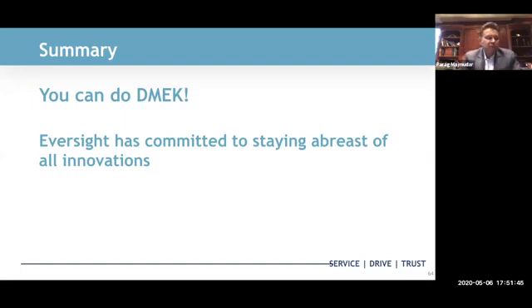If you're asking about how to estimate the size or the amount of the bubble post-op, so in the clinic the next day, it's really ballpark. I'm not sure it really matters that much whether it's 80% or 85%. The number one thing is that it clears the inferior iridectomy, so that there's aqueous covering the iridectomy. That way you know that there's continual flow and you're not going to have pupillary block. But as long as it's on the first day of the surgery, post-op day 0, when I see them in the office, I'd like there to be about an 80 to 85% air fill.